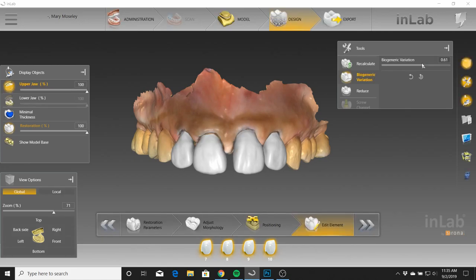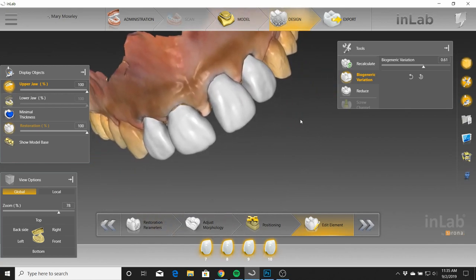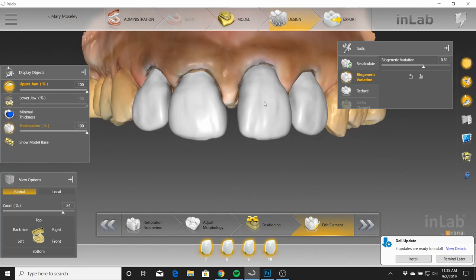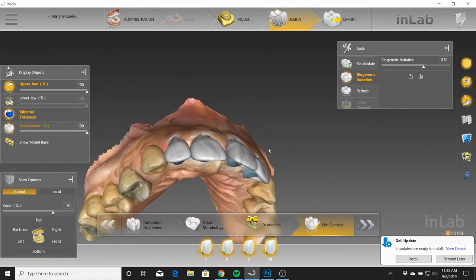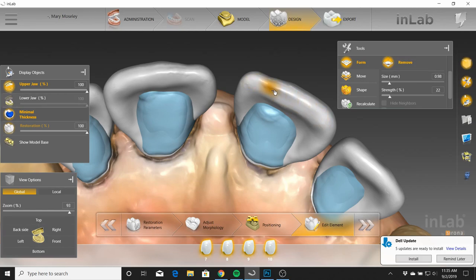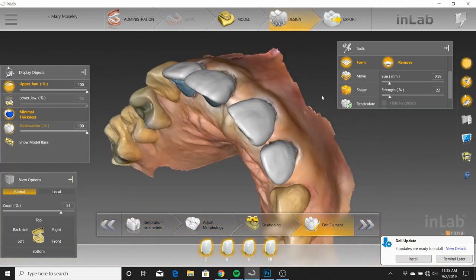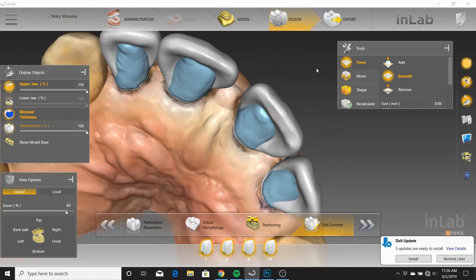Here are the initial proposals. You can see what I mean when I say we made chicken salad out of chicken a**. We weren't given the most ideal situation to work with, but we made it happen. I started out with biogeneric variation at about that setting, then I filled in the spaces, refined the line angles, and took care of the minimal thickness. Then I took the form tool — remove — and left the strength at about 20-ish. You don't want to make it too dramatic because then you lose control. I went along the incisal edge with that, and once I got the wear marks I liked, I went in with the smooth tool and smoothed it out.